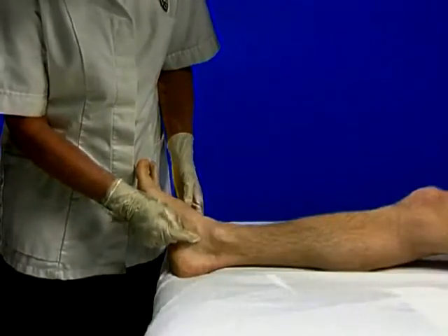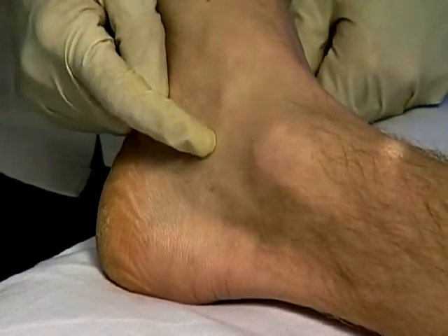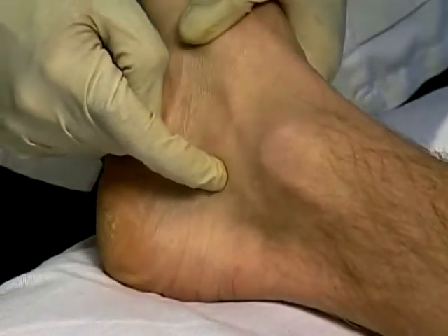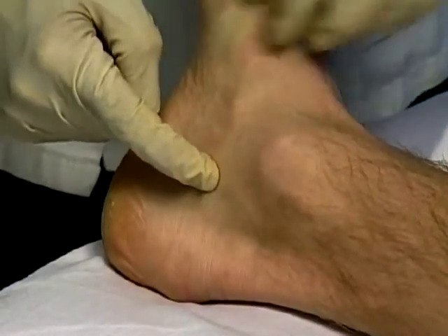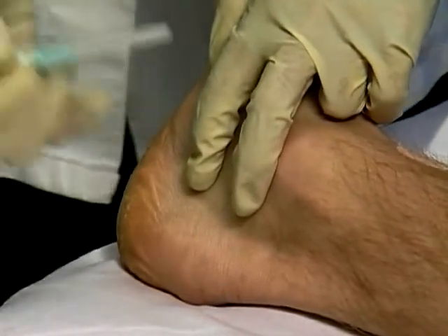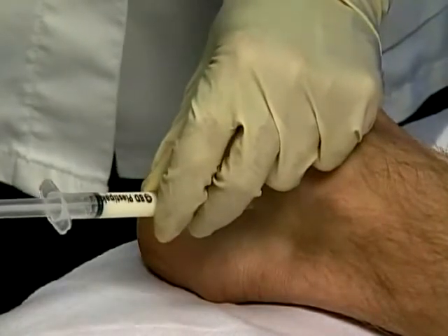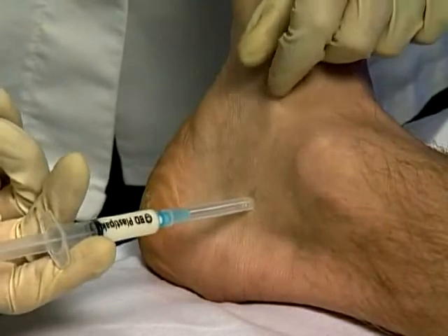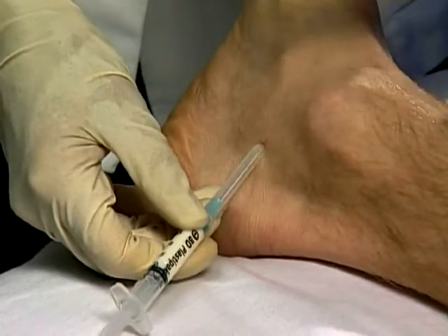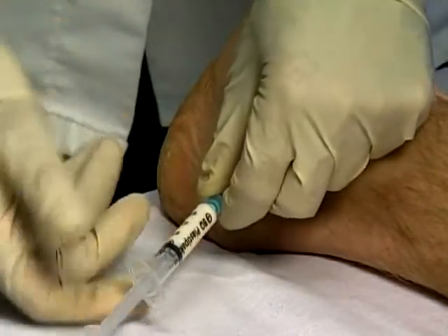Palpate the sustentaculum tali, which lies immediately below the medial malleolus. Just posteriorly and slightly above is a small gap which is identified by tilting the talus. Mark the entry point here, clean and firmly stretch the skin, and rapidly insert the needle perpendicularly into the joint space. Aspirate and inject half the solution here. Slightly remove needle and angle anteriorly to pass through the septum that divides the joint. Inject remaining fluid as a bolus.